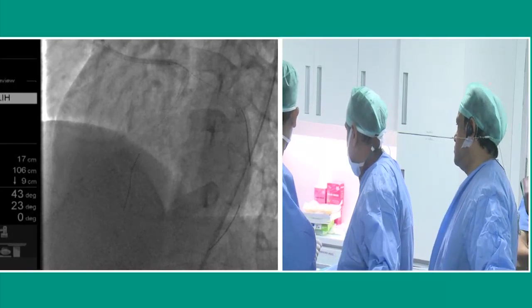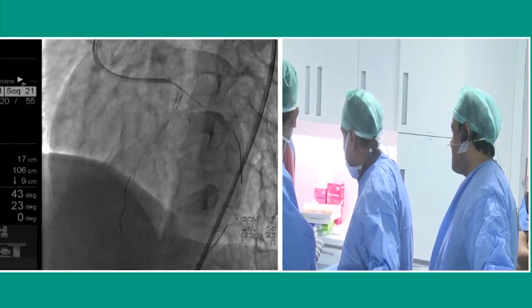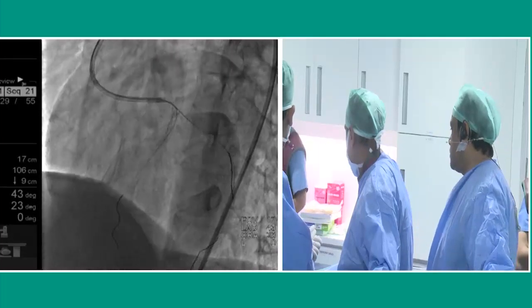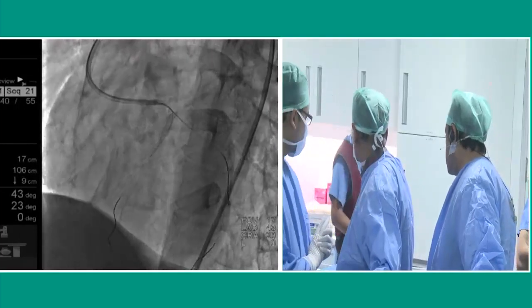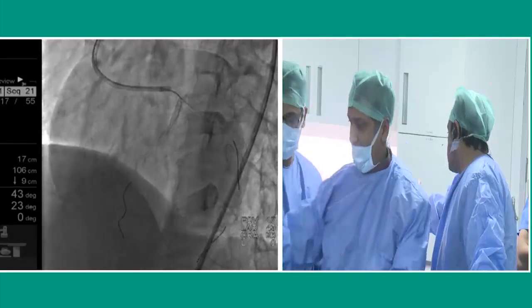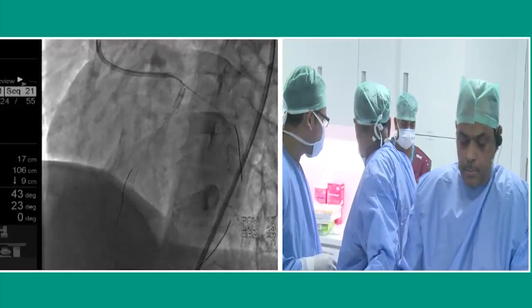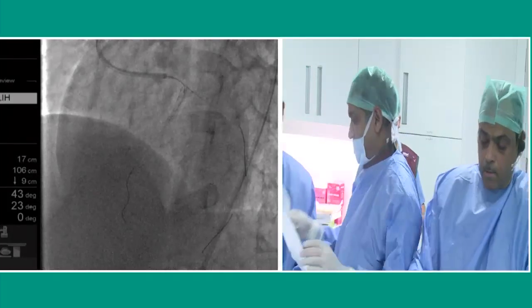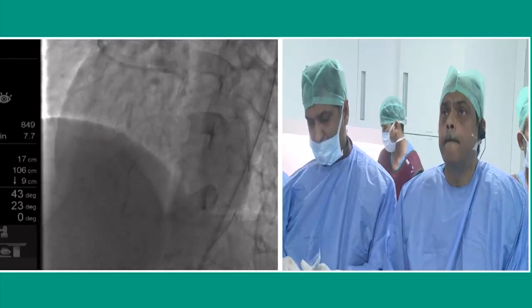Oh my God. For left main bifurcation, this is quite a serious problem for provisional stenting. So if we could consider back, we have to prepare a better strategy to prevent the side branch stenosis. As we know from DK crush or culotte, sometimes it's safe for side branch patency for the next 6 to 12 months. And this, when it happens, it's quite difficult to treat.